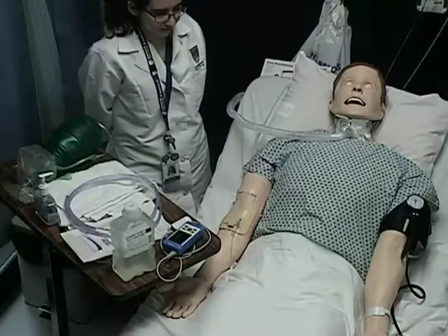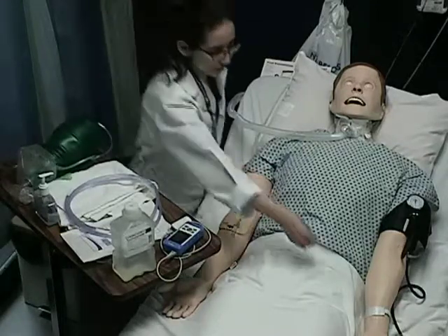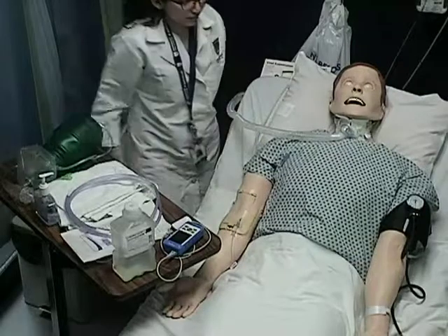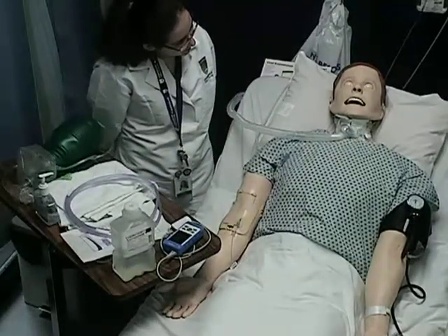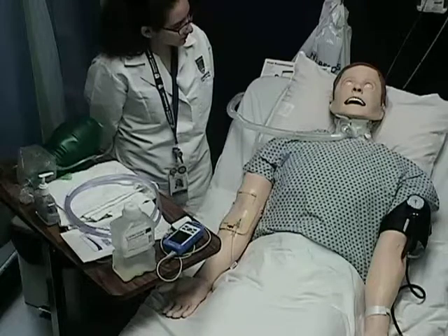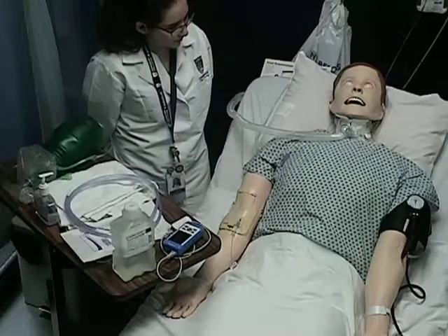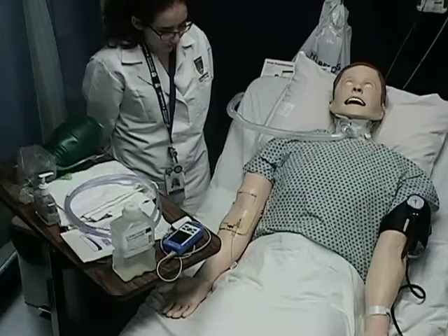Suctioning. Step 1, assessment. Identify patient using 2 identifiers. Assess for signs and symptoms of airway obstruction requiring suctioning. Assess symptoms associated with hypoxia and hypercapnia. Assess for risk factors for airway obstruction, including pulmonary disease, level of consciousness, fluid balance, humidity, gag reflex, and anatomy.